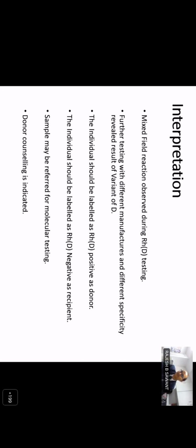Most of the time, if this is missed or not done, there is another concern. If you are dealing with a case where antibody formation is a possibility, then antibodies form very fast, within a few hours also. And then you need to screen that individual for those particular antibodies along with your cross-matching. So that is the reason why the subsequent sample is asked. But the preferable testing should be done with the initially drawn sample of the patient, because a sample drawn after transfusion of 4 or 6 units is essentially not the native sample, but the transfused sample.